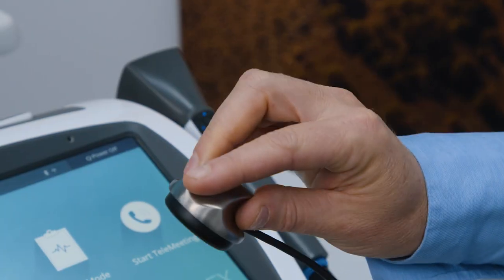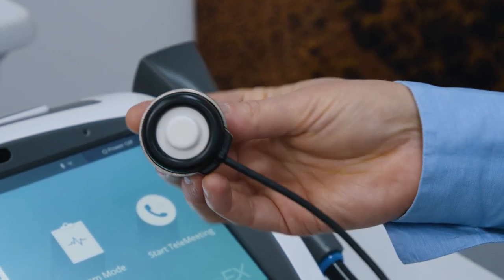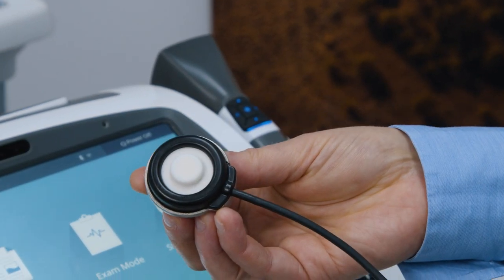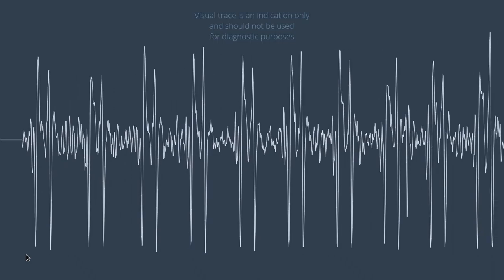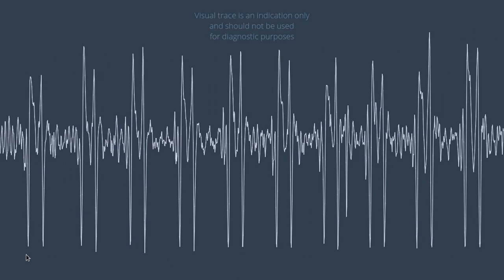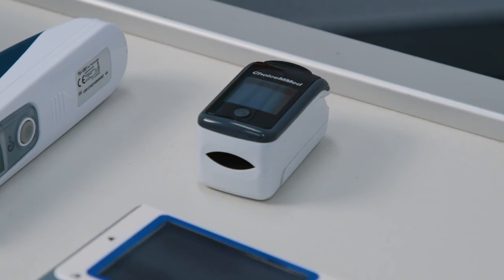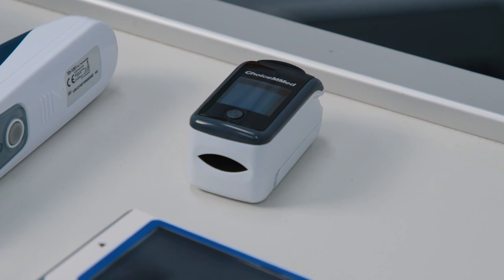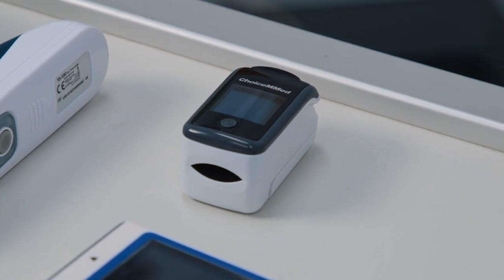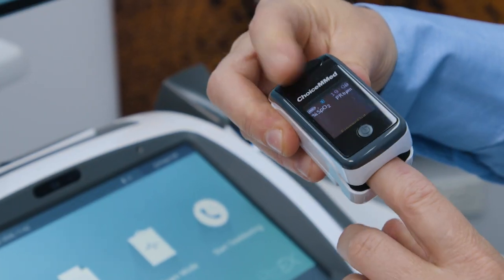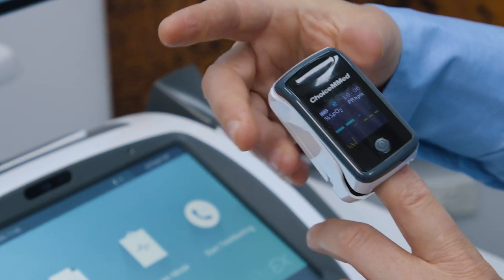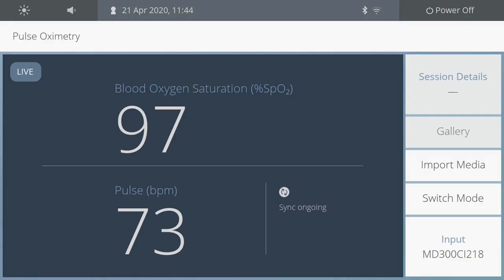The digital stethoscope can be used with headphones for heart and lung sounds, with the audio going to the doctor at the other end of the call. Pulse oximetry can be monitored by a small pulse oximeter, which can stream live data.